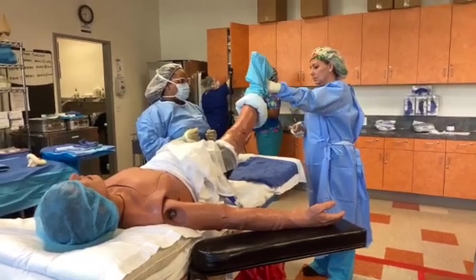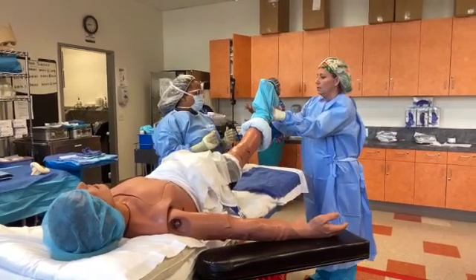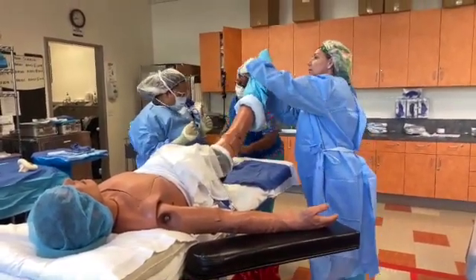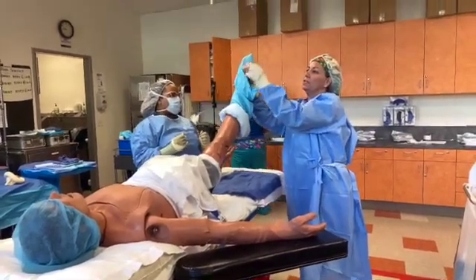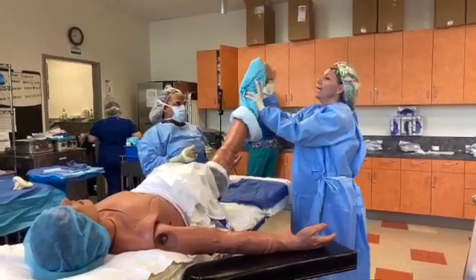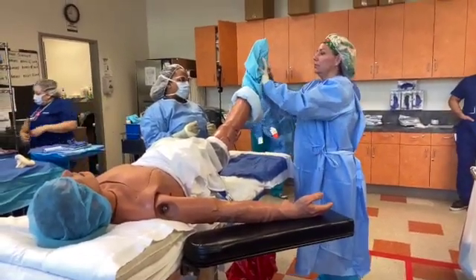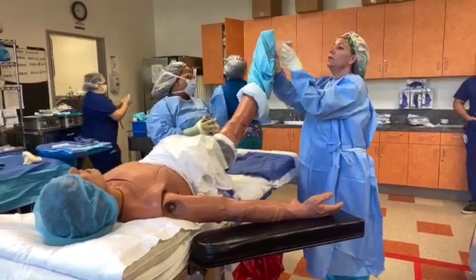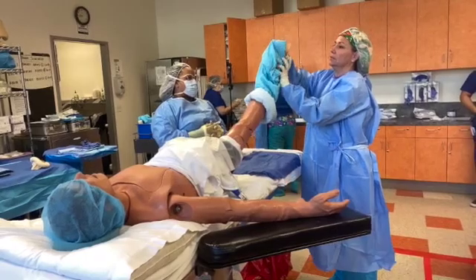You're the assistant, so you do what the surgeon says. And one thing you're watching, Miss Bree, you just contaminated. You gotta be careful. It's all about body mechanics. I always start this first, so I don't have to sit here and struggle. And I always do it this way. See, there's 2 ways to do it. The scrub, you can do it this way, or you can unravel it this way.